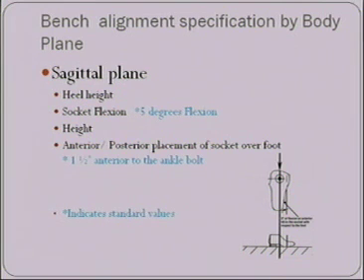And there's also socket flexion, so we have to flex the socket 5 degrees, and that's just a standard bench alignment value. You can see this is a vertical line right here. Well, this vertical line and the anterior of the tibia here shoot off on a little bit of an angle. So this is about 5 degrees of flexion or anterior tilt of the socket.